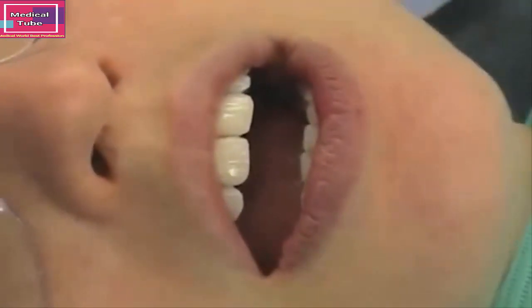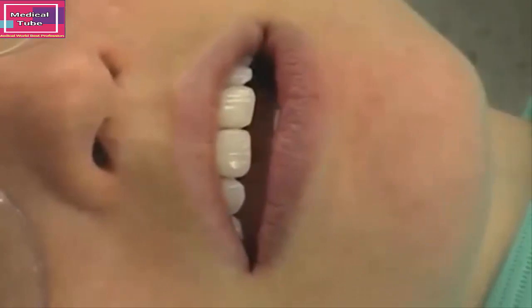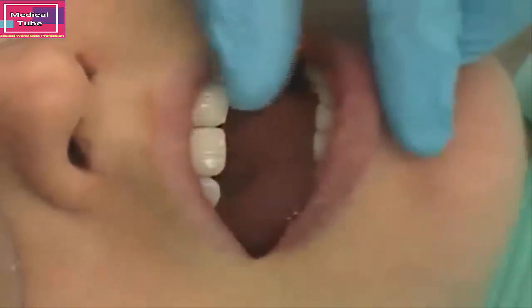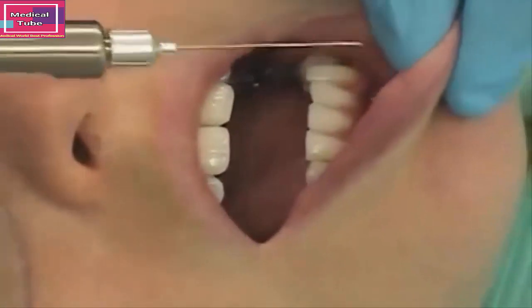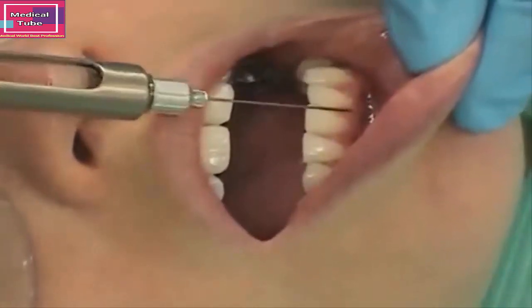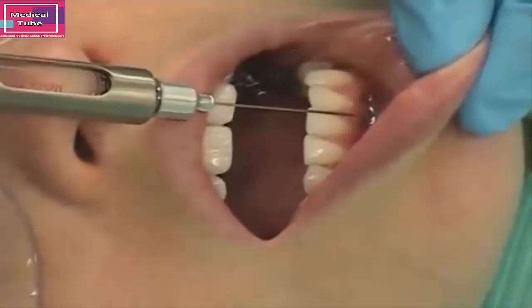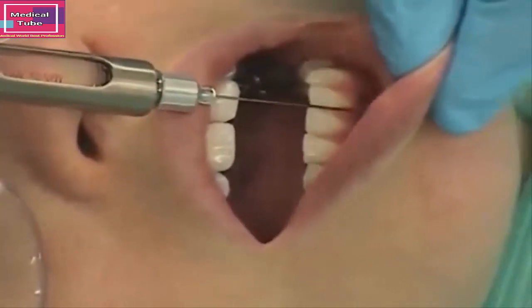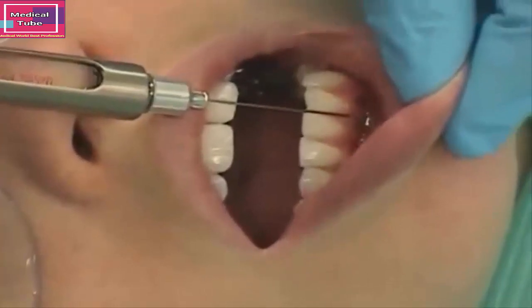The syringe position and location of the area of the injection is parallel with the long axis of the tooth, at the height of the mucobuccal fold and over the target tooth. Like so. The bevel orientation is going to face towards the bone. There will be no pressure anesthesia.